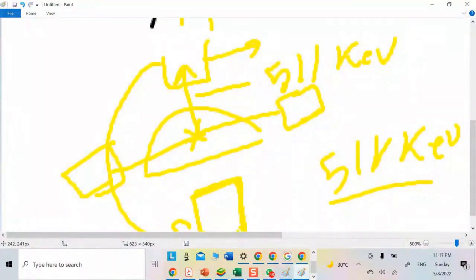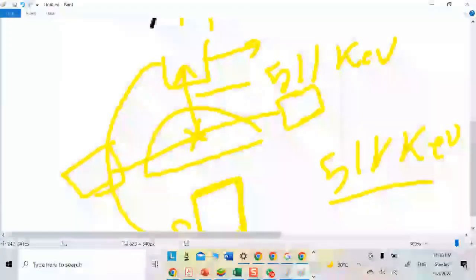So, can it achieve localization with me? Yes, exactly. Is that clear? Yes, it's clear. So, I have eliminated the scatter and the random, right? This will improve the resolution of the image, and the localization of the activity or the position of the region of interest. All right, that's good.